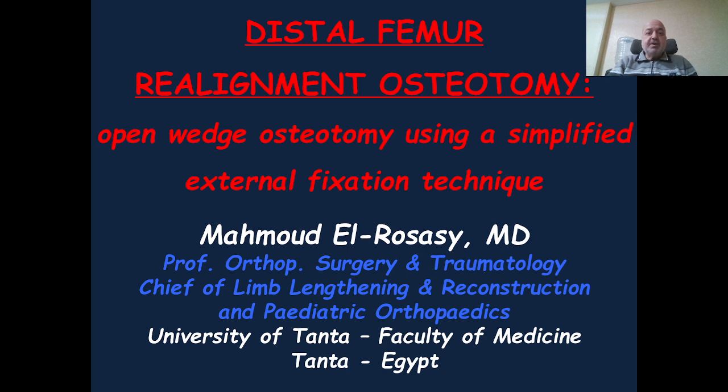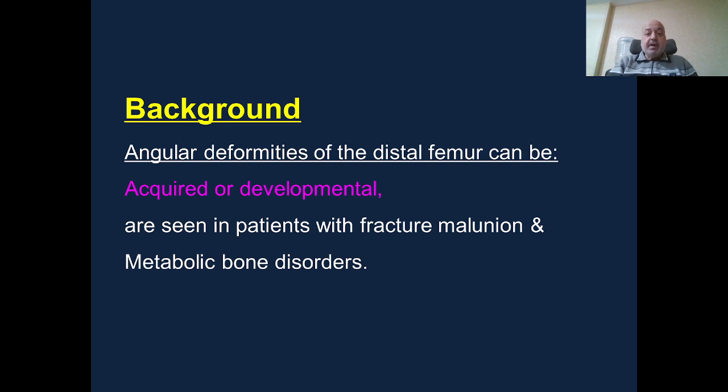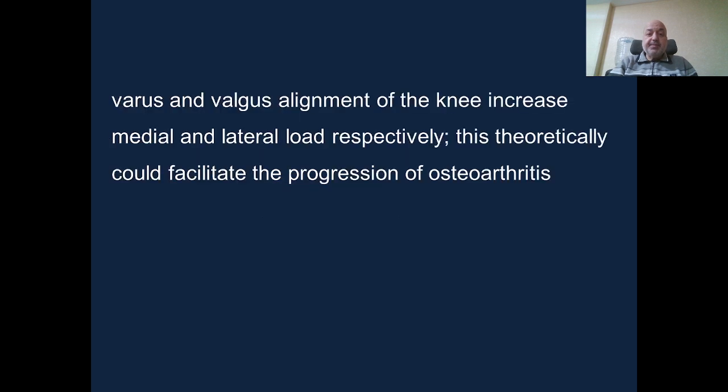I'm presenting our technique for distal femur realignment osteotomy by open wedge osteotomy using a simplified external fixation technique. Angular deformities of the distal femur can be acquired or developmental and are seen in patients with fracture malunion, distal femur growth disturbances, or metabolic bone disorders.